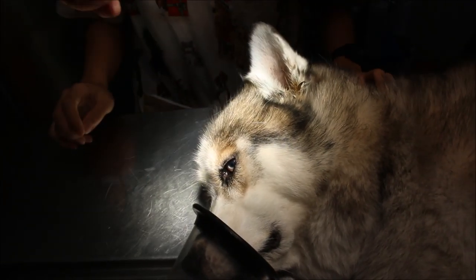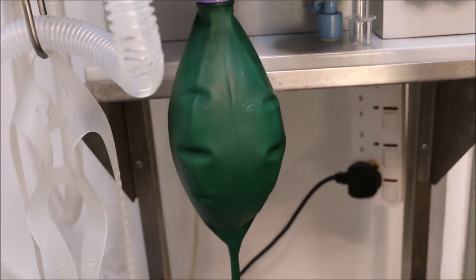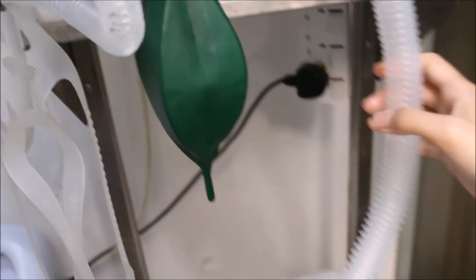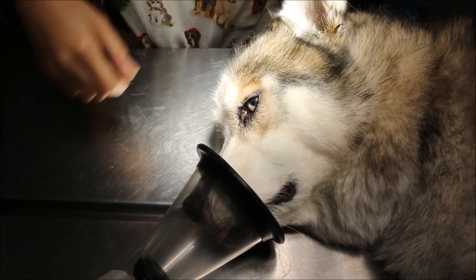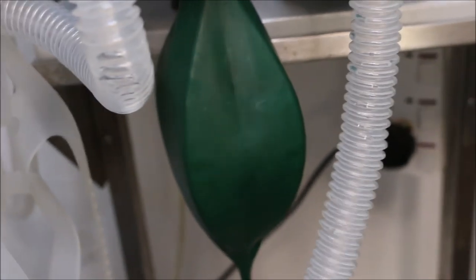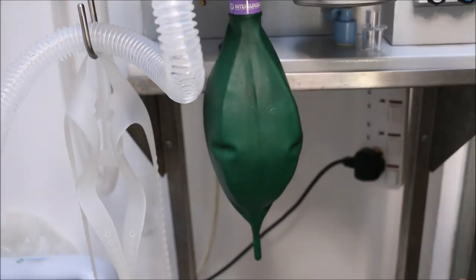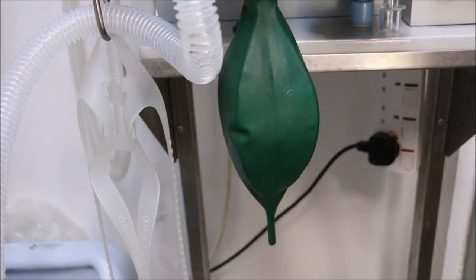You can see the rebreathing bag. Although it's closed circuit, the rebreathing bag is moving very well. If it's really closed, the bag will fill up and stop moving. We adjust the red valve — turn it a bit more to get it properly closed. If it's really closed, the rebreathing bag wouldn't be moving; it would be inflated. Turn the red valve to the point where it is more closed.